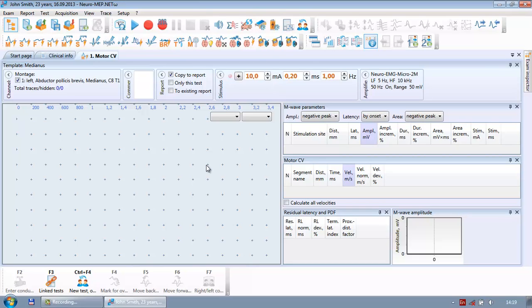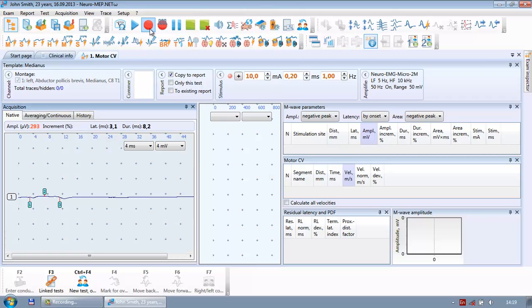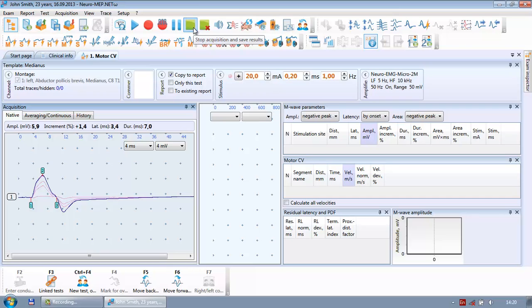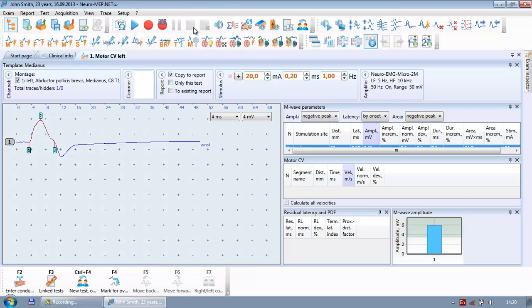The software is ready to start the test. To make a stimulation, I place the electrode on the medianus — the first stimulation point is the wrist. Once the electrode is placed, I press the button on the keyboard. I see a response and I increase the stimulation current to see if the amplitude grows. I keep increasing until it is no longer growing, which means I have reached the supramaximal level. I press 'Stop Acquisition' and save results.